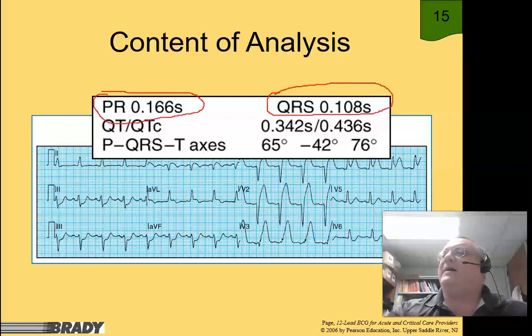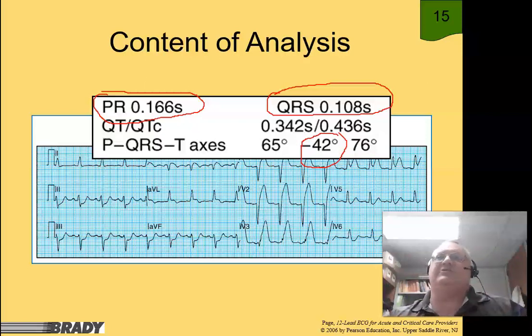We've already talked about it a little bit, but I'm really going to go into it deep about why that QRS axis is going to make a huge difference. Because this is going to tell us exactly where it's originating from and the path the electricity is traveling in, especially in the ventricle. Okay, so again, we can tell a lot about damage, or maybe not necessarily abnormalities, but certain syndromes that happen because of that QRS axis.